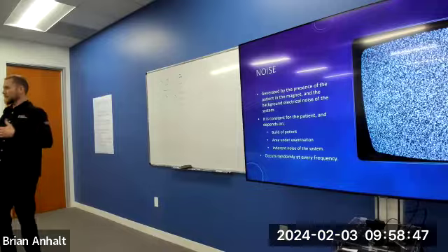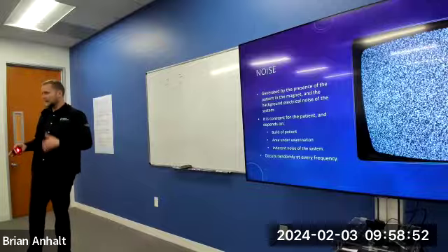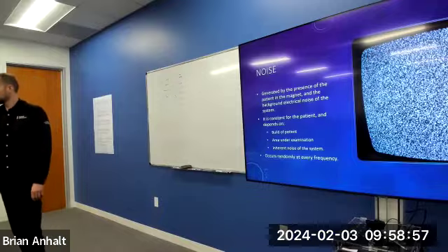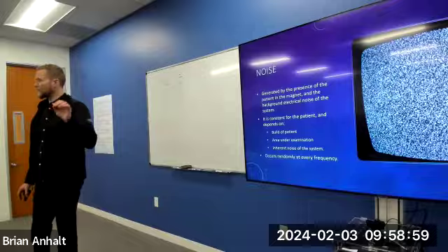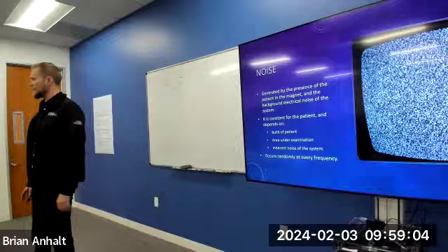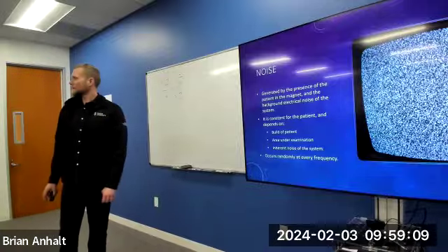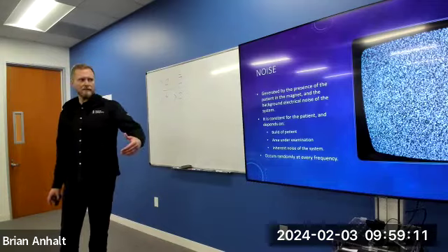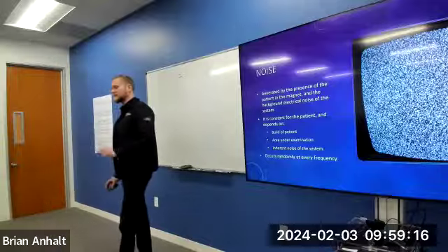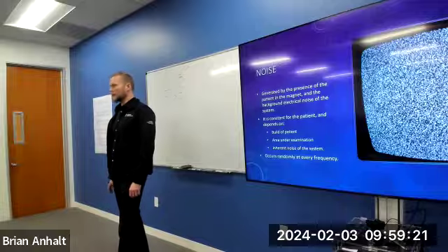Or if you're thinking, say your coil's broken and you're using a different coil, you think, okay, this coil's not gonna produce as much signal, so I need to make adjustments beforehand and hope that I get better quality images. Or if the radiologist says, I really don't like the T2 contrast on this, make it better, you need to know what to do beforehand. The patient will still be on the table at that moment, but you should know what to do at that point.